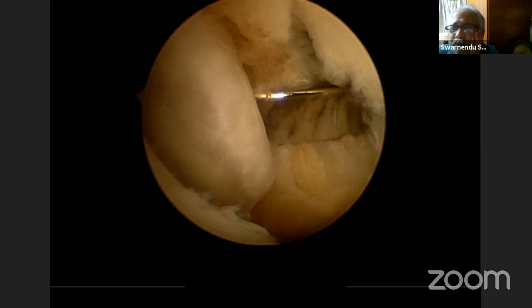So when you do the arthroscopic ankle arthrodesis, how do you put your screws?